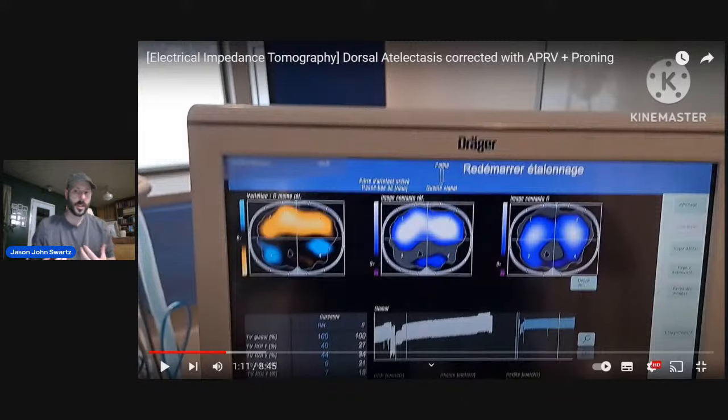Okay, and the white is very, very useful in showing us where a higher amount of the volume is being distributed. So here we see there's aeration on the top, and obviously because there's hardly anything at the dorsal region, the majority of ventilation, this white, appears here. The more intense it appears, you want that distribution to be as evenly distributed as possible. So you don't want big white spots maybe on the right upper quadrant area or anything. You want it as smoothed out as possible.